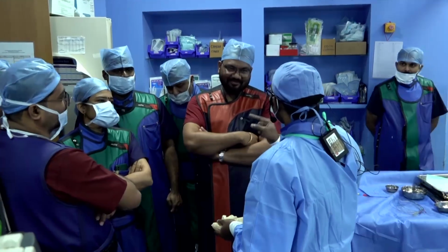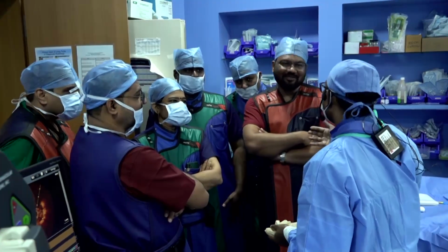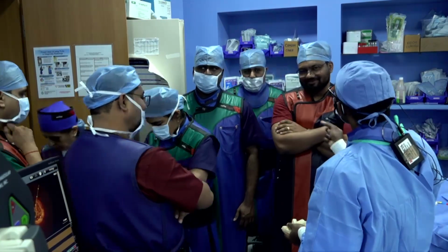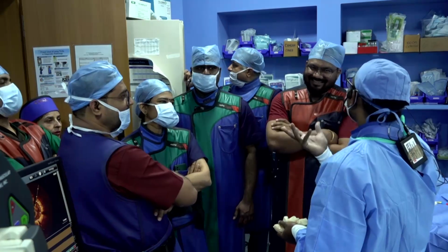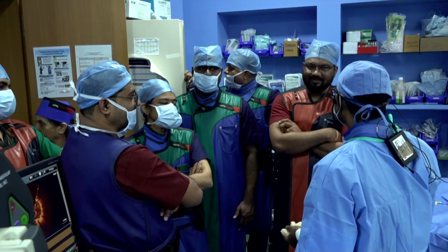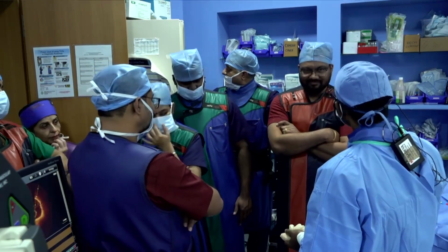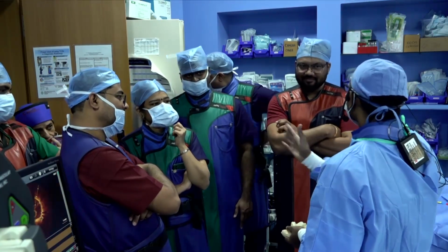Whatever you do, at times you tend to miss the ostium. But rather than missing the ostium, and again, if you have some lesion in left main, you're happy, you can have the stent all the way. But without any problem in left main, why would you want to cover the entire left main? But for future intervention, having the stent way back into the left main is always safe, not protruding into the aorta.